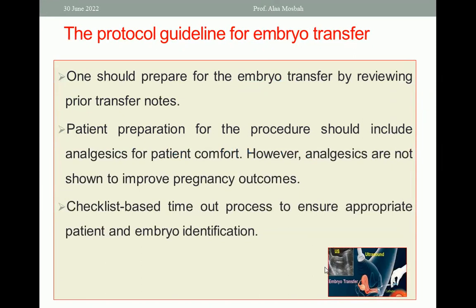Starting with, one should prepare for the embryo transfer by reviewing prior transfer notes. If the patient has had an embryo transfer before and there are notes from the doctor who did this procedure in the past, you should read these notes. Okay.